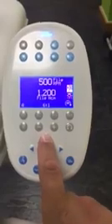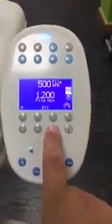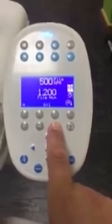And there's two other adjustments that we can make in here. So again, if we go into the menu using the plus and minus and use the chair up and down keys to navigate through and across. If you've got optics within your motor, you can turn this on or off with this light bulb icon here. And then just above this speaker icon, you can actually turn the beep off if you don't want that. Most people will tend to leave that on.